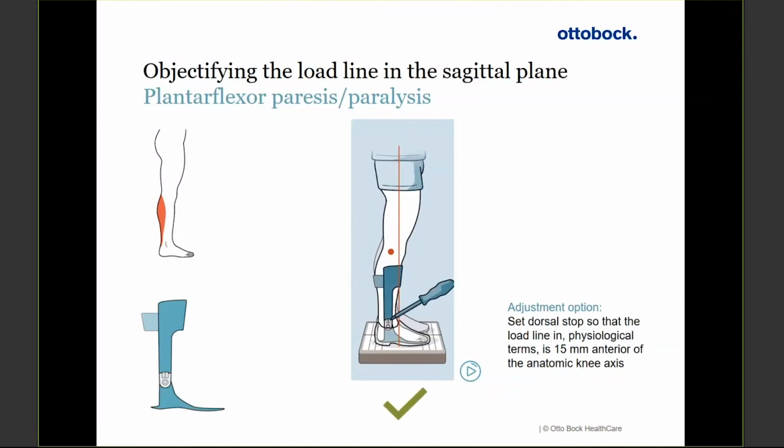The other thing that's important is that patients change their alignment over time, just like prosthetic patients, right? So rather than blaming the device all the time, we always blame maybe post-polio patients for breaking their ankle joints, right? But really what may have happened is that over time, their load line has shifted, and now we can see where we need to adjust their orthosis. We'll go to the next one.